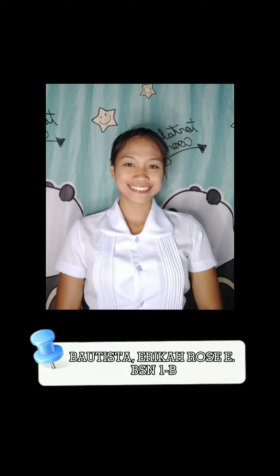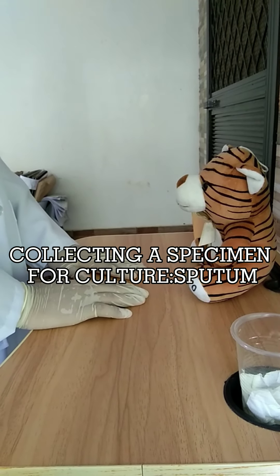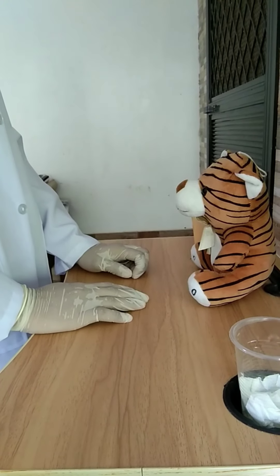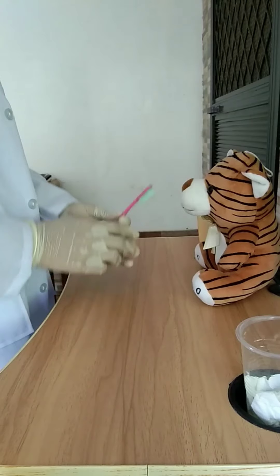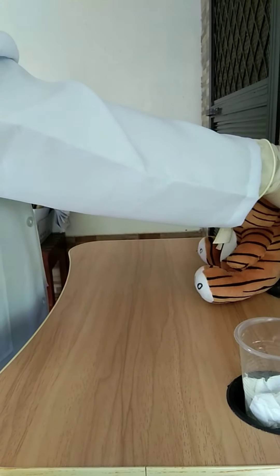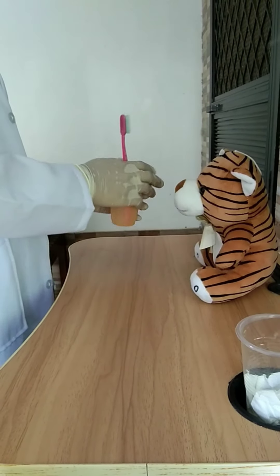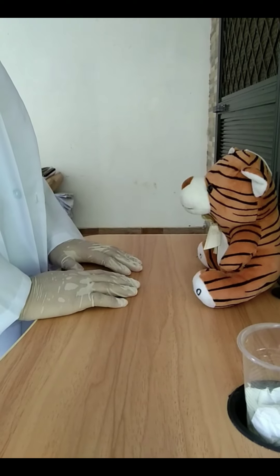Good morning sir, my name is Erika Rose E. Bautista from BSN 1B and I will be your nurse for today. First, collecting a specimen for sputum culture. Ask the client to remove any possible contaminants from the oral cavity by brushing his or her teeth or by using a mouthwash. Then ask the client to cough forcefully after taking several deep breaths.